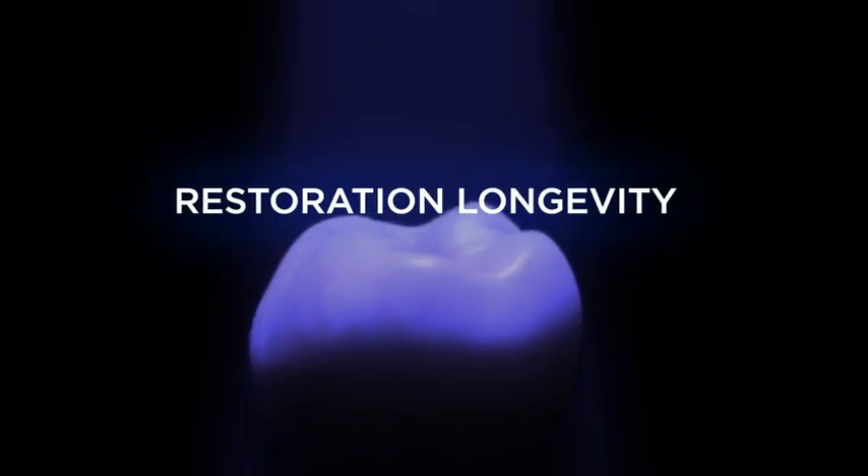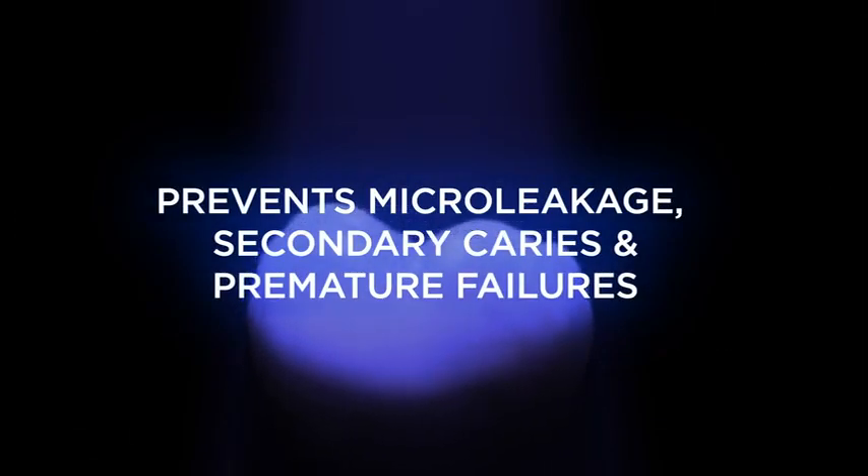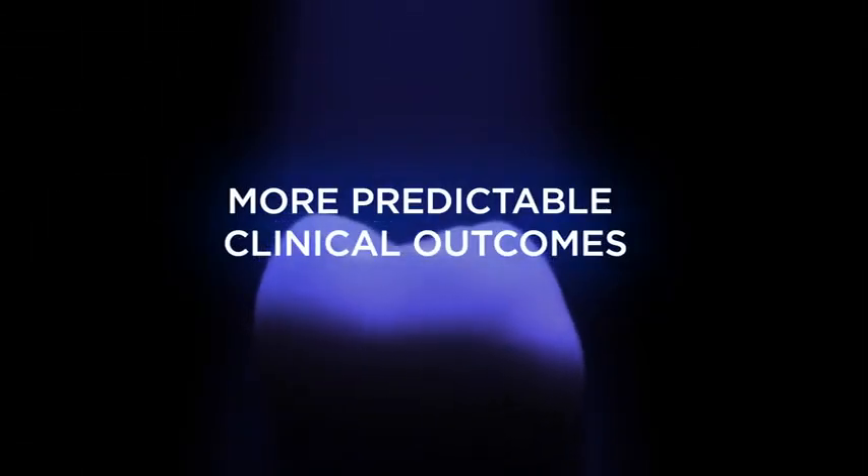Proper light curing ensures restoration longevity, prevents micro leakage, secondary caries, and premature failures, and delivers more predictable clinical outcomes.